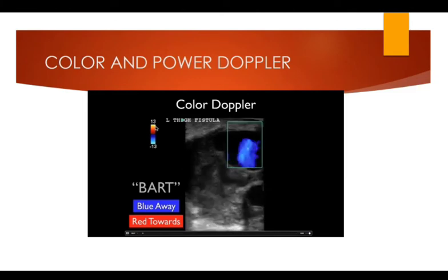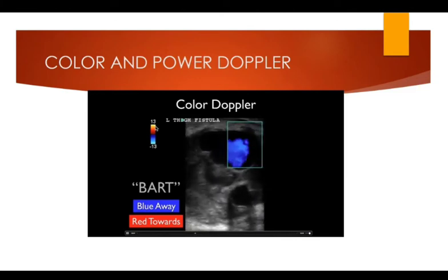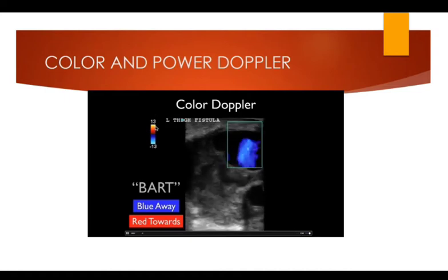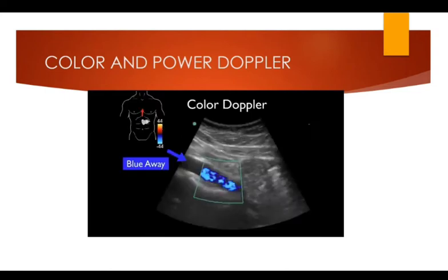Now here, this is a little confusing. We see both blue and red going on, and that's because this is a pseudoaneurysm. Essentially, that blood is cycling round and around in this structure. So here we're over the abdomen of a patient, and we're looking at the aorta. If you notice the angle of this probe, we've got the probe marker towards the patient's head, and then this towards the feet, but we've angled down towards the pelvis, and that's why we get this slanted view of the aorta.